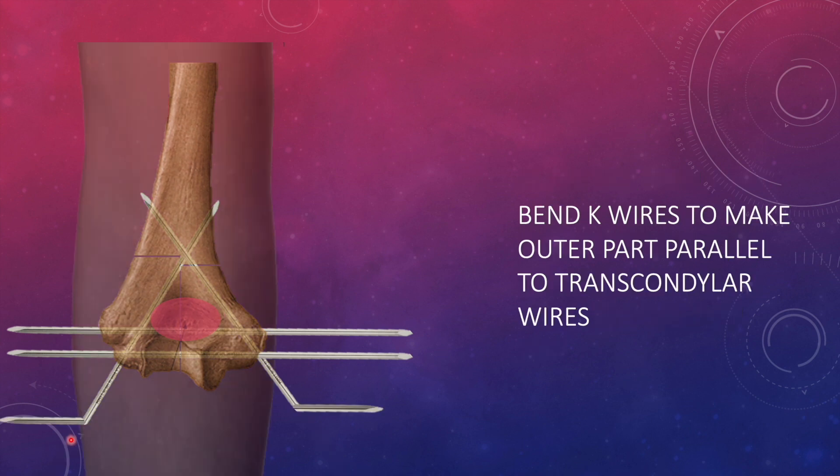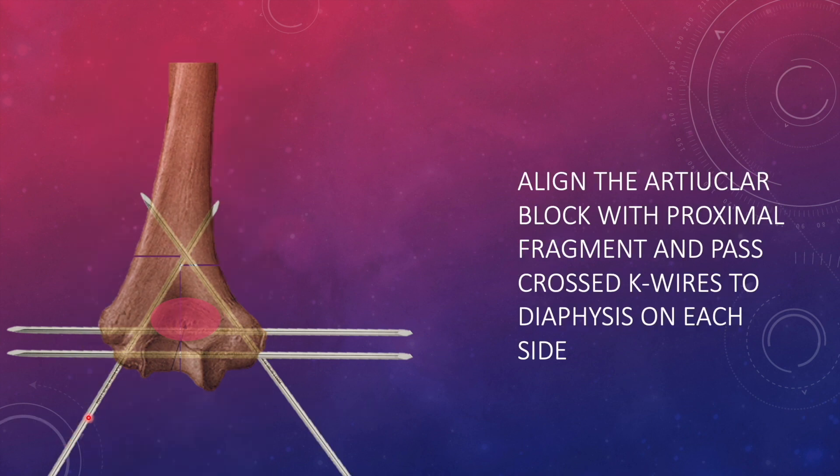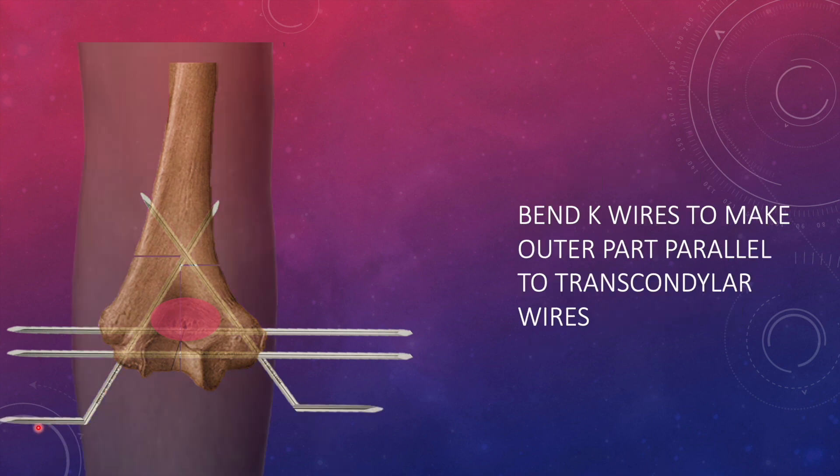Once that is done, you have to bend the terminal wire. The wire which was here, it has to be bent in line with the axis of the other transcondylar wires like this. Once that is done, then you are ready with your metaphyseal block.